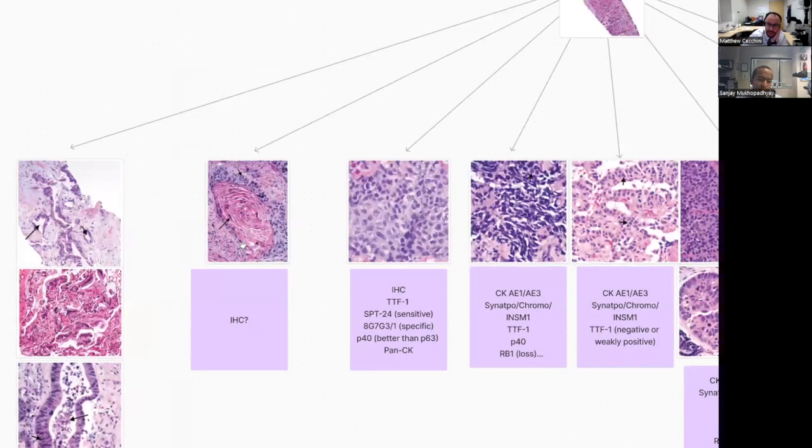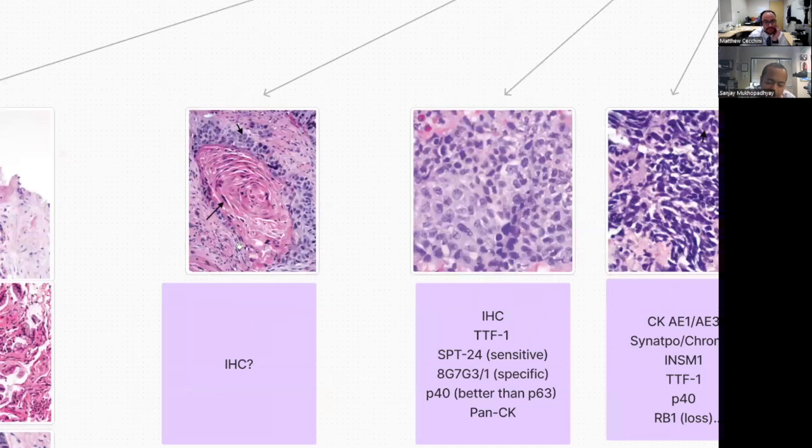Here's a question for you, Sanjay. What do you do if someone's got a urothelial history and they have a squamoid type lesion? Oh, great question. I find that immunohistochemistry can be helpful there. We are trying to say, is this squamous cell carcinoma or a urothelial carcinoma, both of which can be positive for P63, P40, and CK5/6.